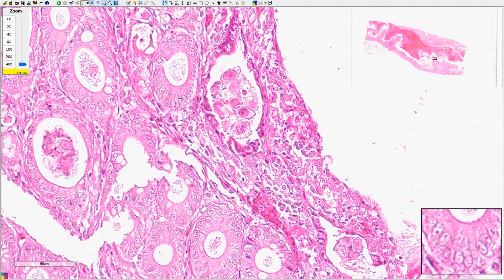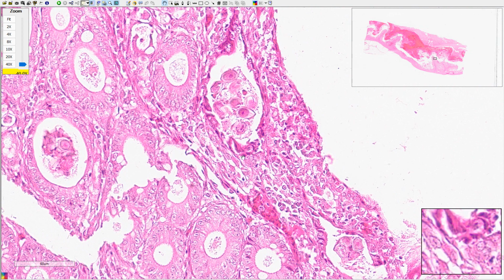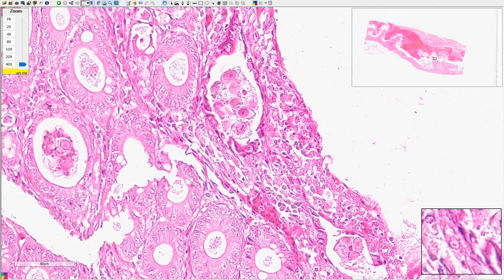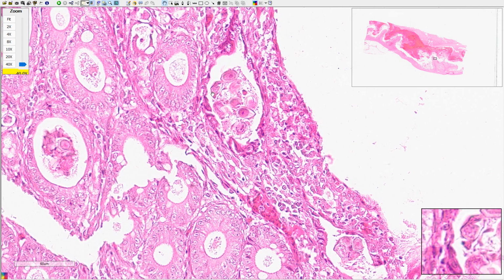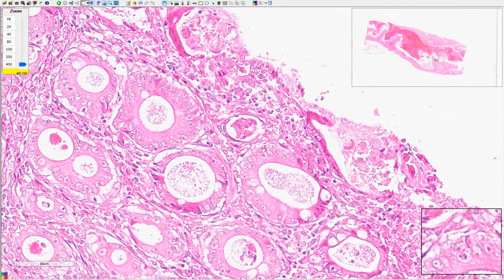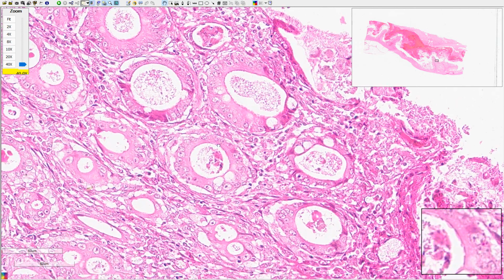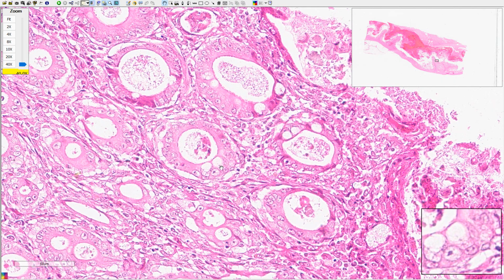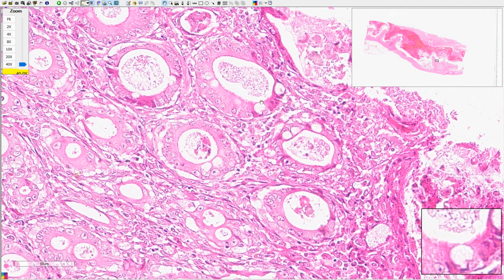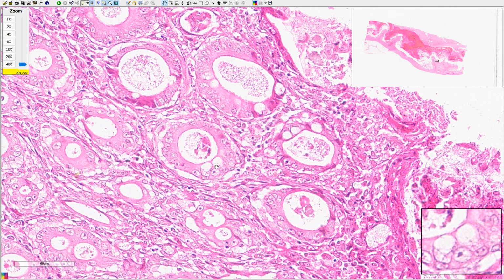This should be the normal crypts, but here you can find pyknotic nuclei or small nuclei with bluish appearance, along with oocysts in the lumen of the crypts. Then you can also see in the epithelia of the crypts there are lots of large goblet cells. This characterizes the formation of goblet cell proliferation.